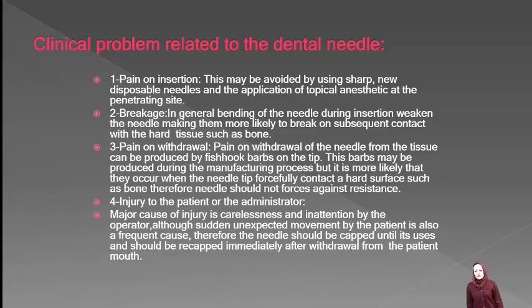4. Injury to the patient or the administrator. The major cause of injury is carelessness and inattention by the operator, although sudden unexpected movement by patients is also a frequent cause. Therefore, the needle should be capped until its use and should be recapped immediately after withdrawal from the patient's mouth.